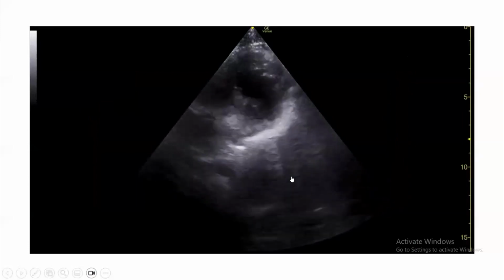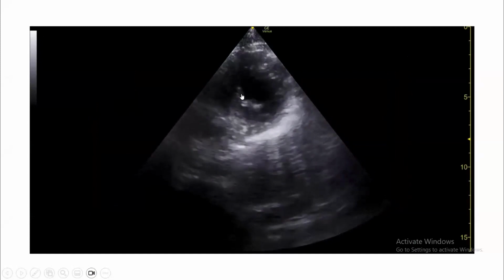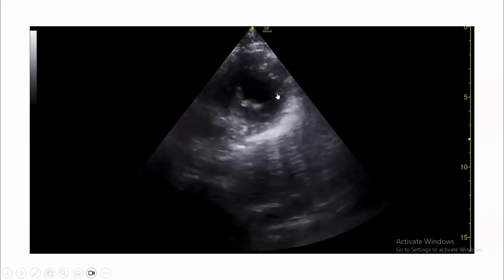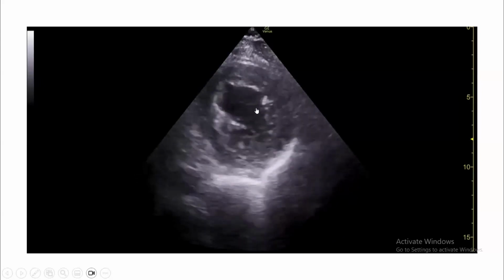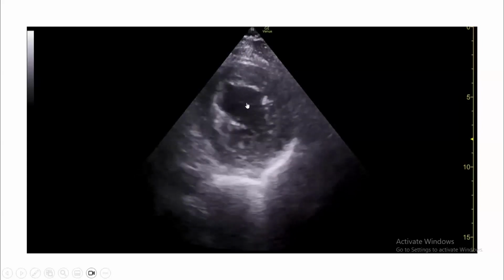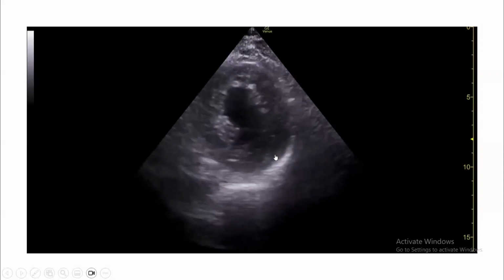What is this? Short axis view. Short axis view with good contractility, almost kissing each other, right? Short axis view. Right? Circular, septum is okay, and the muscle almost attaches to each other. How about this one? Circular really, but this is poor contractility, no flattening of the septum, right? But the contractility is mildly depressed, because it's not attaching or not coming to each part of the papillary muscle.